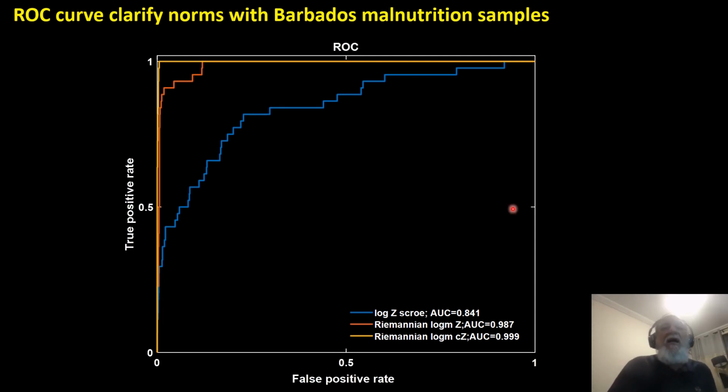And what we see, if we only look at the log spectra, we get a significant, but not that impressive AUC. If we then use the full cross spectrum, it increases a lot. And if we do batch correction and also a method called contrastive principal component analysis, we get very good discrimination. So these issues of harmonization are important in making, let's say, normative data use.